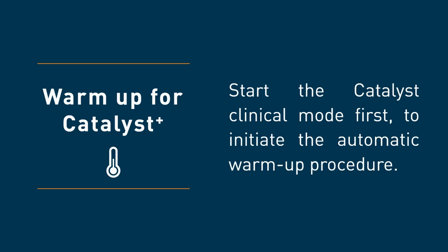Should you consider a software restart, you might need to wait for another system warm-up depending on the time the restart took. A full computer reboot, which might take up to several minutes, will result in an even longer warm-up period. Hence, I recommend starting the Catalyst clinical mode as soon as possible to initiate the warm-up process. The advanced mode can then be used without any limitations in parallel to the warm-up process.